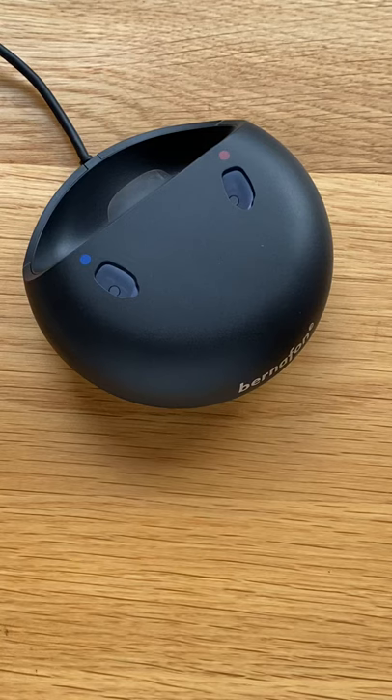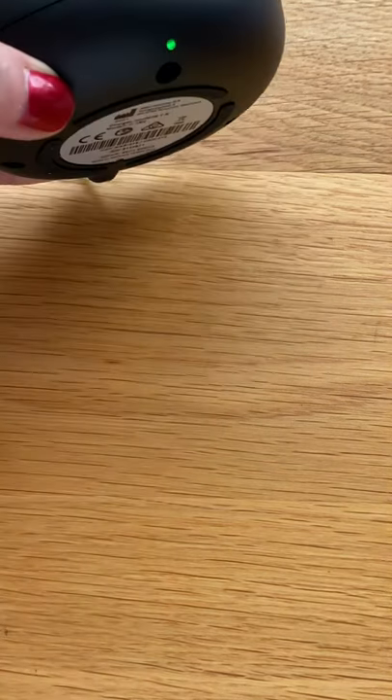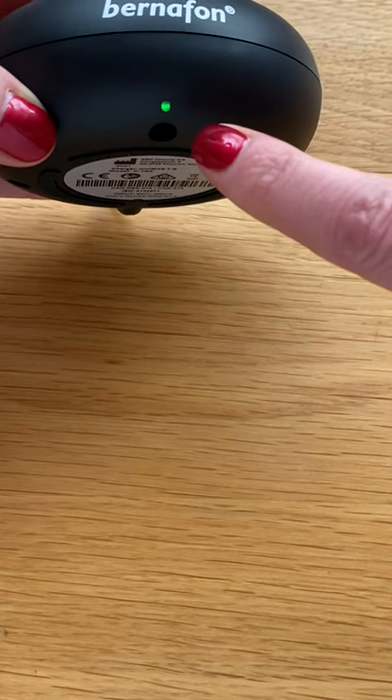In this video we are going to show you how to charge your Bernafon Alpha hearing aids. First of all it is very important to make sure that the charger is plugged into the wall and that the socket is switched on. We know that the charger is powered up because this green light is showing.